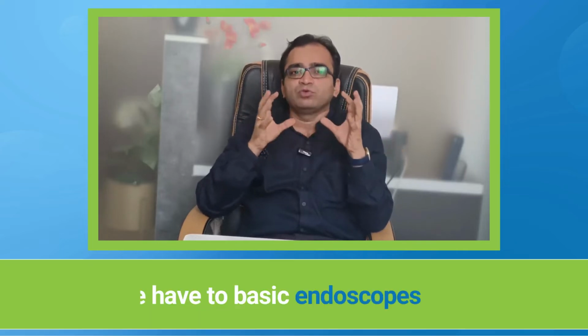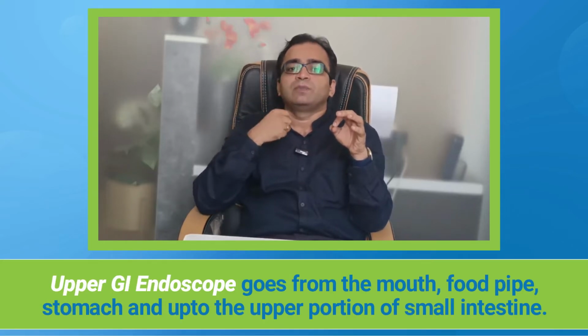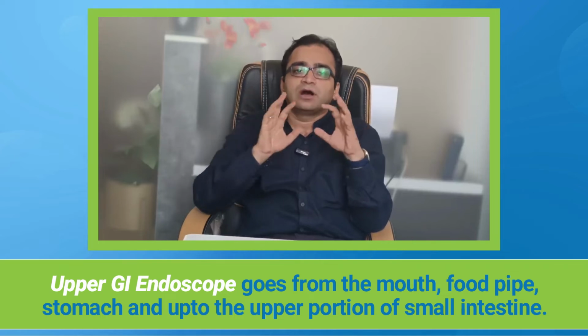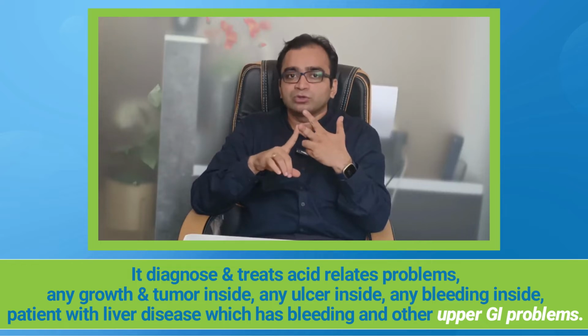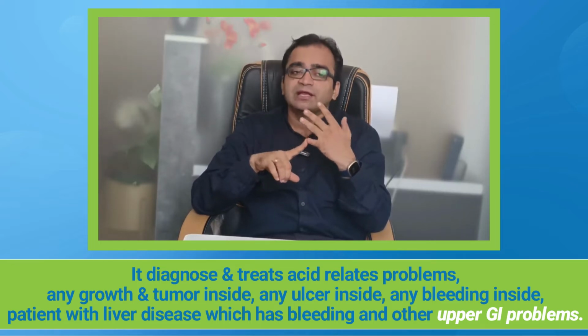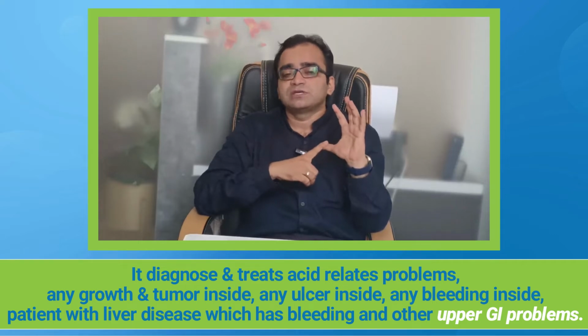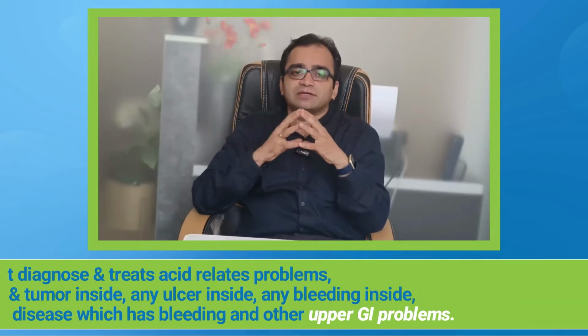As a gastro practice, what are the endoscopes we have? We have two basic endoscopes. One is an upper GI endoscope and one is a lower GI endoscope. Upper GI endoscope, simply put, goes from the mouth, food pipe, stomach and up to the upper portion of the small intestines. And what does it rule out? Any acid related problems, any growth or tumor inside, any ulcer inside, any bleeding inside, any patients with liver disease who have bleeding, or any others who are having symptoms related to the upper GI.